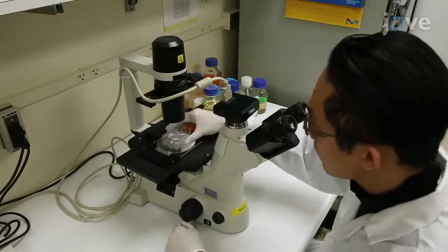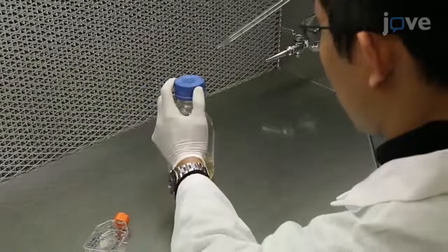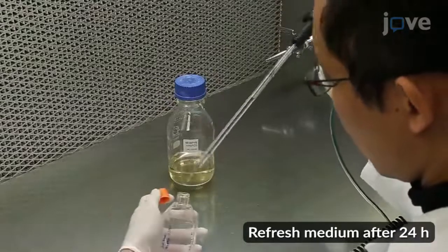After confirming attachment under a light microscope, gently replace the supernatant with 5 mL of fresh medium before returning the flask to the incubator.